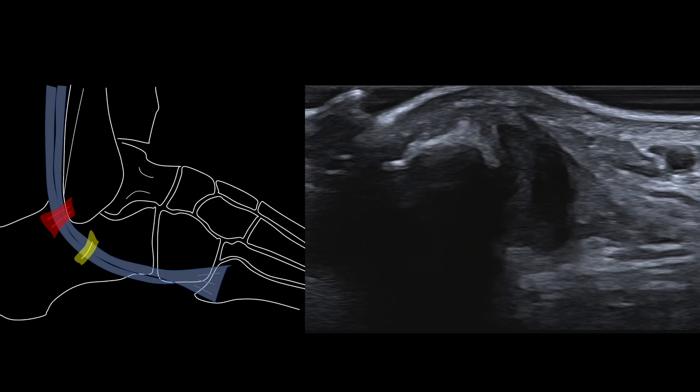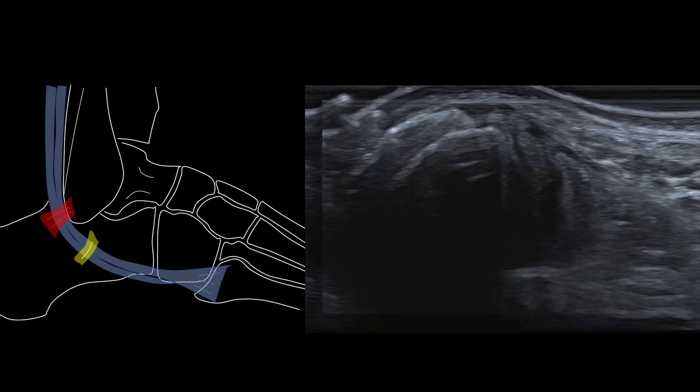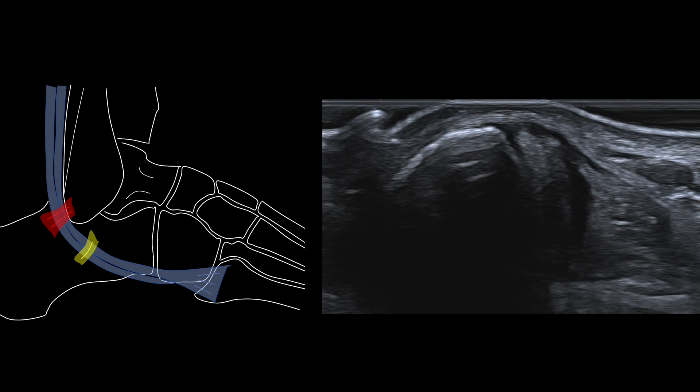To identify the SPR we simply scan the peroneals. This hypoechoic triangular structure coming off the fibula is the superior peroneal retinaculum.